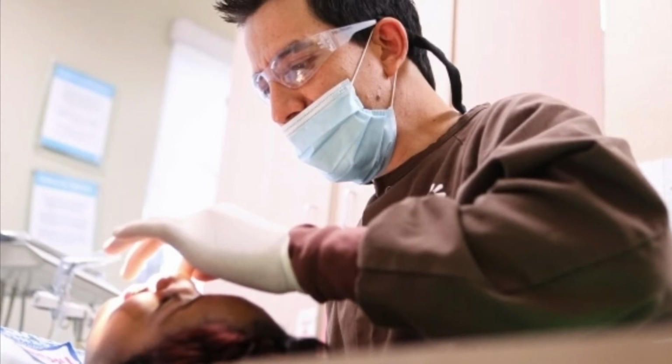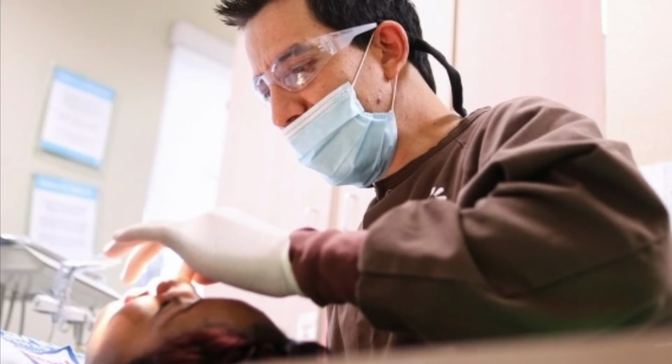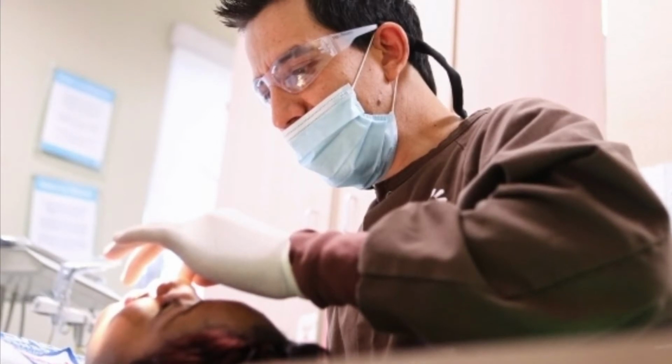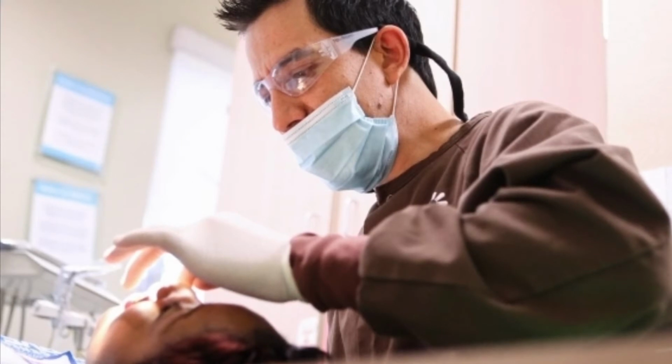Number 1, diagnosis and location of hard and soft tissue. Number 2, location and shape. Number 3, working length. Number 4, position of anatomical structures.